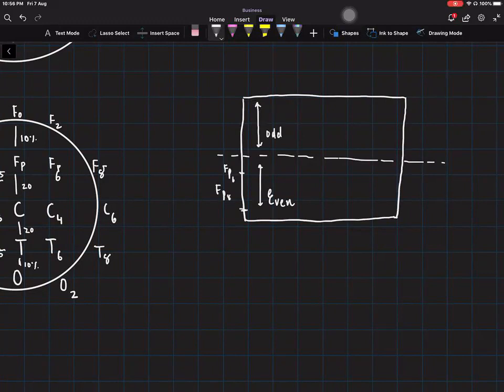So what this does is essentially it's not an individual lead's reading, but what you're reading is the gap or the change between these two leads. So you're using this lead as a reference point and this lead as a reference point, and then you're reading what differences there are in the electrical activities at these leads.